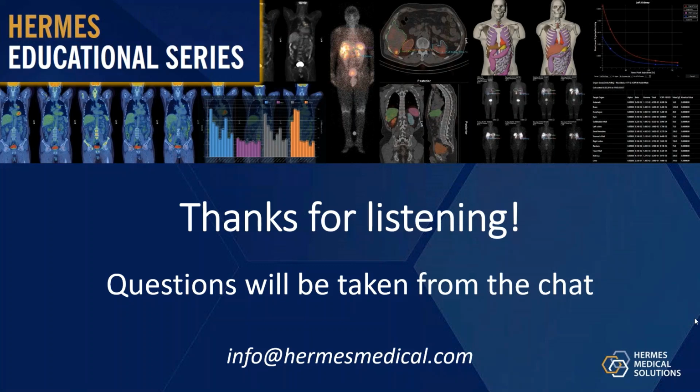The next question is from Matthew Walker. Very nice presentation, thank you. You mentioned that the detector is part of the Monte Carlo model. Does Hermes support the latest CZT detectors or only the older NaI ones? At the moment only sodium iodide, but there is some research work going on on the CZT side also. But let's see what happens in the future.